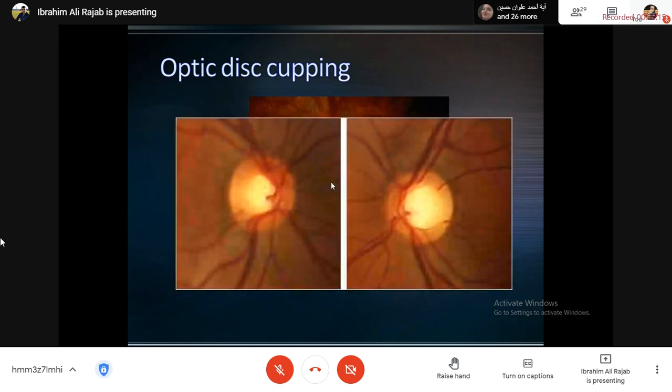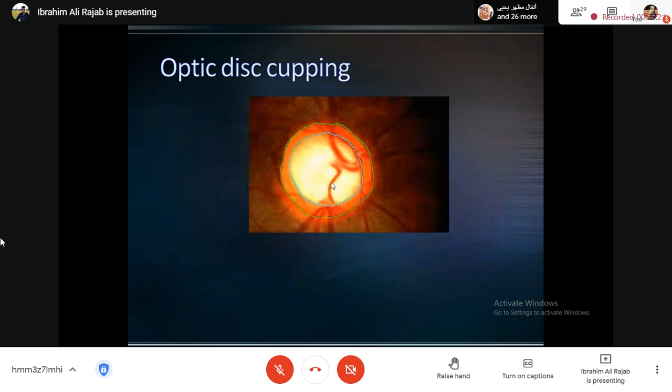خلينا نشوف آلاء فلاح. آلاء، تقدرين تقولي لي إيش قد طول الكاب إلى طول الديسك كله؟ دكتور، تقريبا 10%، لو 20، لو مثلا 30؟ 7/10 أو 8/10. انت رحتي للأصعب، صحيح كلامك، تقريبا 7 إلى 8/10، بس تقدرين تقوليها بالمية حتى يفهمون زملائك؟ يعني 70 أو 80%. صح، طول الكاب تقريبا محتل أكثر من النص من طول الديسك، 70 80% تقريبا.